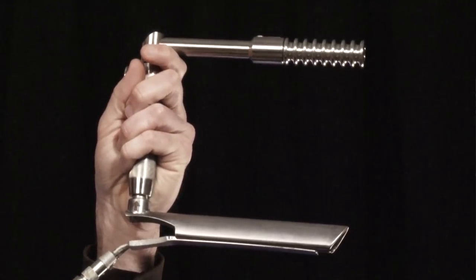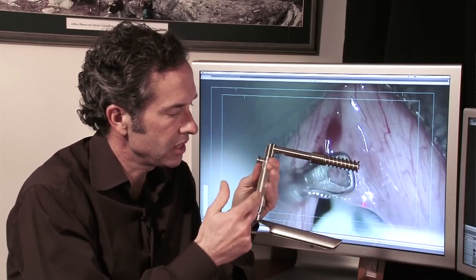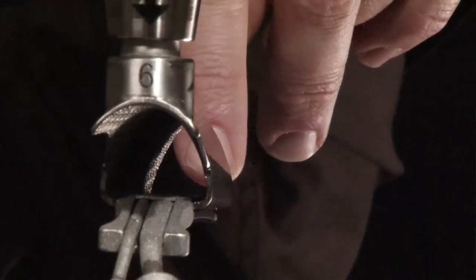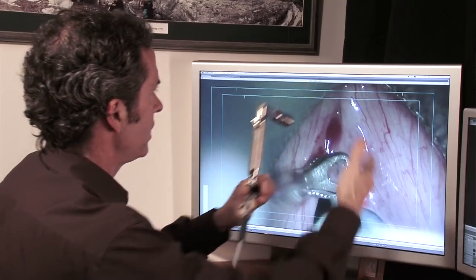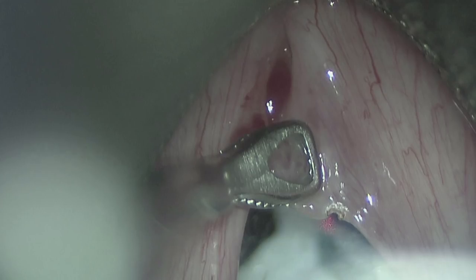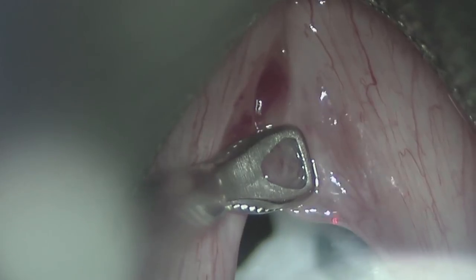We're going to do a surgery on him. To do that, we're going to use an instrument called a laryngoscope — this is a Zytel's laryngoscope. It has a handpiece to hold and a piece to look through. I'll put this in Richard's mouth and lift the tongue up to get a straight shot down to see his vocal cords. Then we're going to use instruments about a foot long with a little grasper on the end, called triangle forceps or scissors, to work with the polyp.